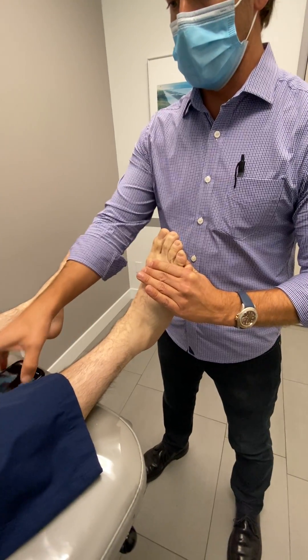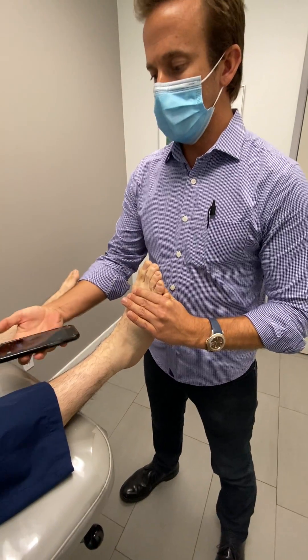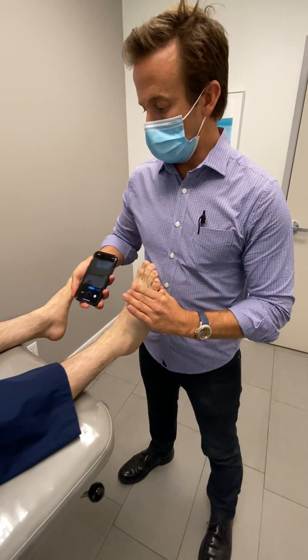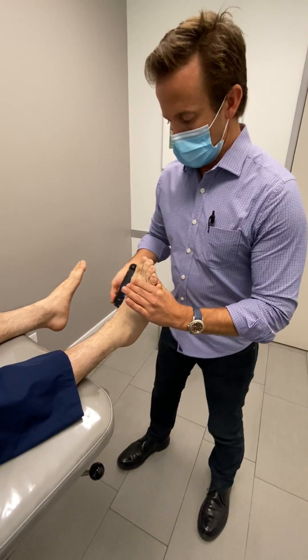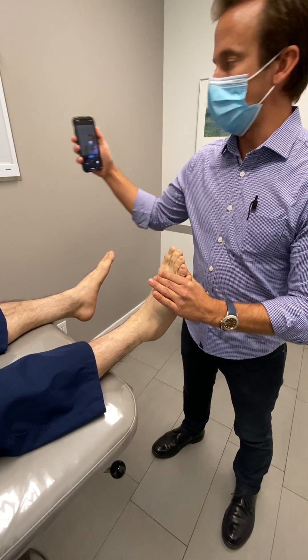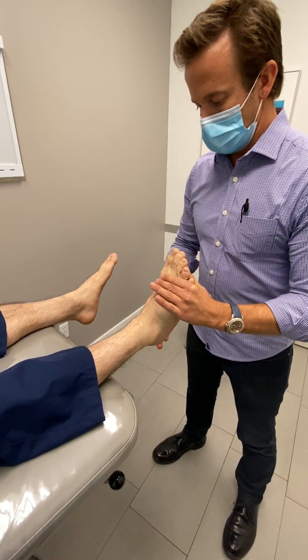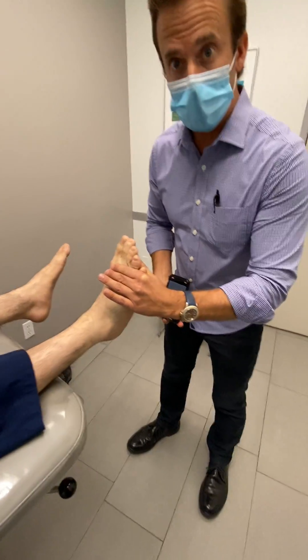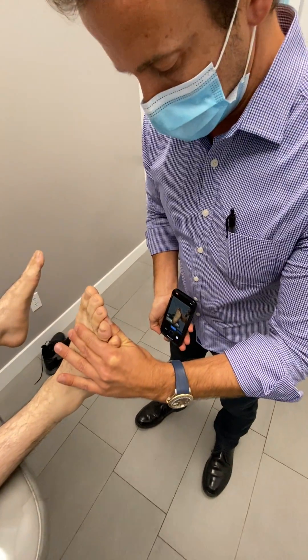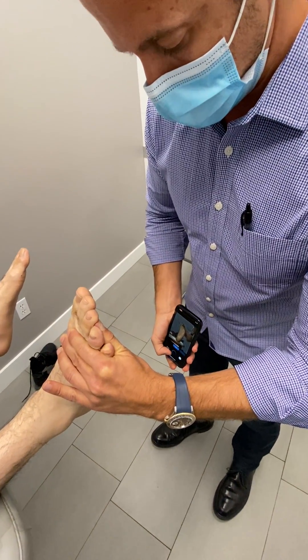Locking the mid-tarsal joint is the traditional way to cast for foot orthoses. This is how I'm holding the scanner — I'm basically going to flip the phone. Rather than holding it like this to take a selfie, I'm going to flip it around like this. I'm holding it this way and I'm going to use my thumb to hold the foot so it's right in the center of the screen.